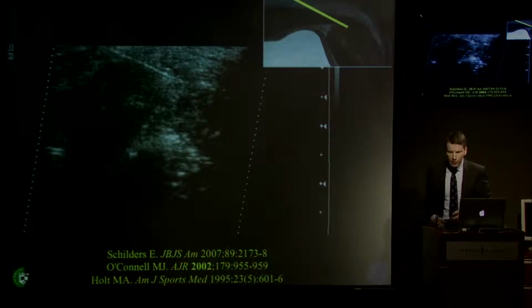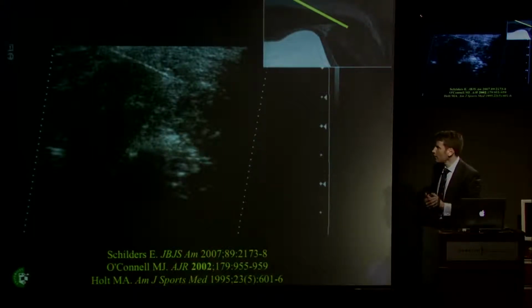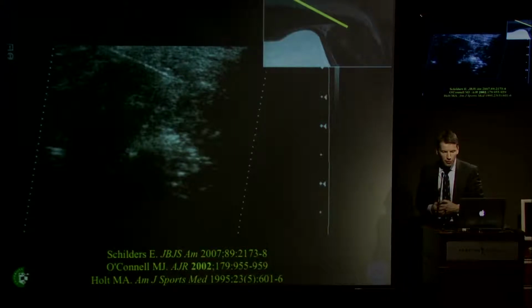And we used to be really clever and try and inject the adductor longus where we saw the edema on our MRI scan. But in fact, when you inject into this area, quite often the player will say they feel the bubbles and the fluid going into their side that's symptomatic. So it's probably going out through that cleft or whatever capsular disruption into that area. So we've stopped doing targeted injections. We just do symphysis pubis. But again, the literature, a lot of it doesn't have controls, and whether we're just giving a long-acting pain relief and whether we're actually doing any other good, I'm not sure.